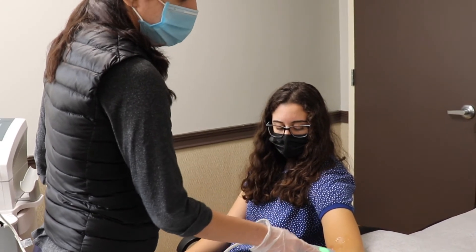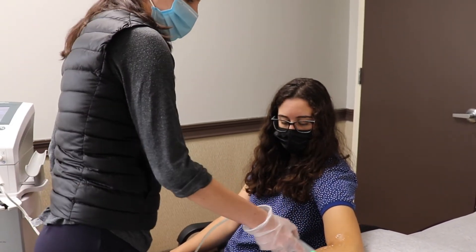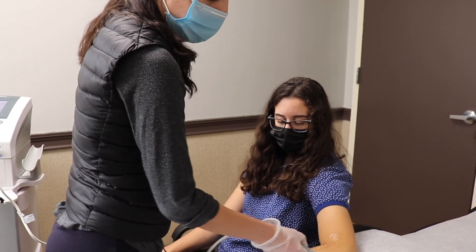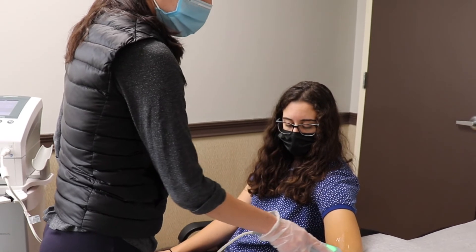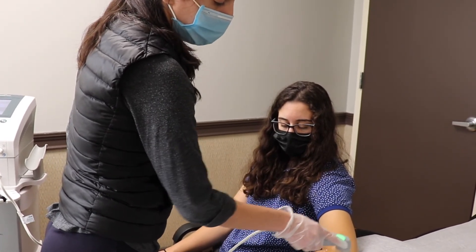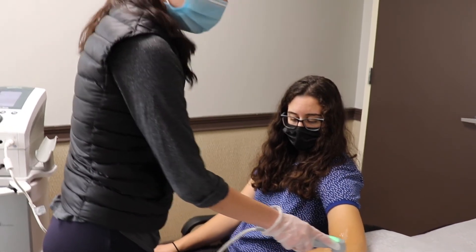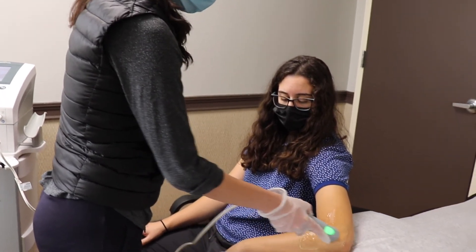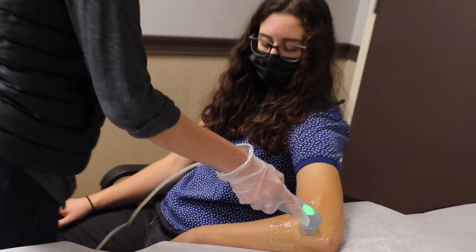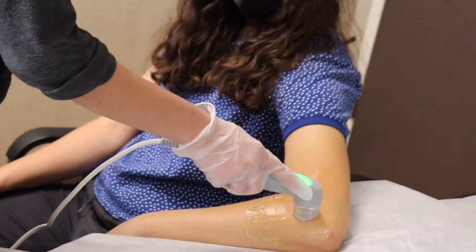Contraindications with ultrasound — there are really not too many. I wouldn't use this with any patient that is a hemophiliac, and if a patient has a pacemaker I'm usually careful with this. But it's overall a very safe modality. If you have any questions about the use of ultrasound, just give us a call and we are definitely happy to answer those questions for you.